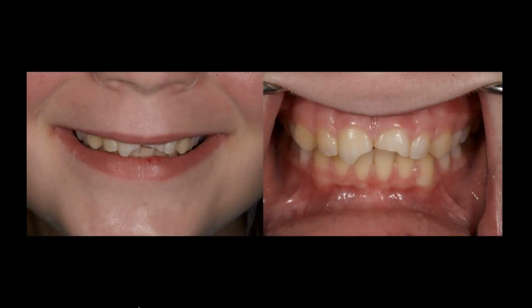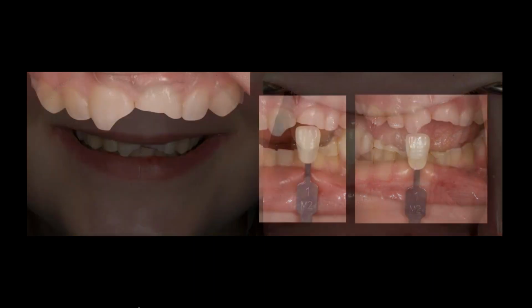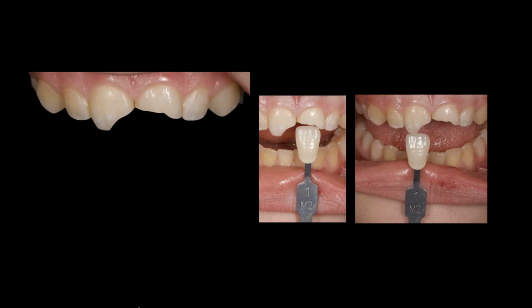Very similar case. I did this one with the newer ceramic, the Lumex AC. This is actually one of the first cases I did with it. I think maybe the second case. In a very same scenario, young girl fell off her bike, broke her 2 front teeth. She's only 15, 16 years old. We're not going to prep those teeth down. You wouldn't want to do that if it was your daughter by any means. So we have to restore. And again, it's about my knowledge now of understanding that opacity from the inside and how to restore those.